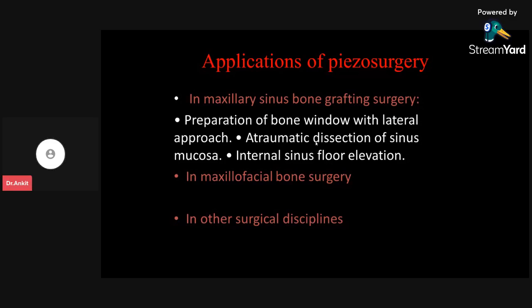And in maxillofacial bone surgery, we can use it. Basically you can use it for orthognathic surgery, which you have already documented, be it iliac crest graft surgery, bicoronal graft surgery, or if you want to put an orbital graft, or you want to do a genioplasty or anterior maxillary osteotomy, you can do this.